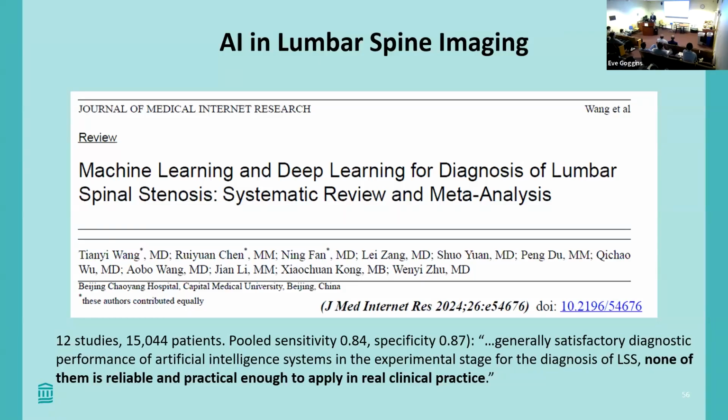Do you have any AI that you use here clinically? Yeah. We actually don't really yet at the Brigham. There's a lot of research in the area. And so how are they being used, for anything spine related? No. Cervical fracture. Okay, PEs. And so it alerts you that there might be a PE. And you find that helpful? It depends. Rib fractures, yes. Brains. Yeah, it has value. Considering how many years we've had it, the progression it's had is very minimal.